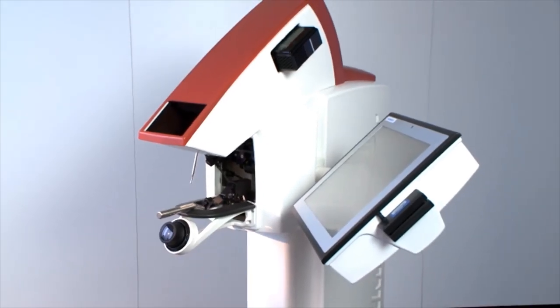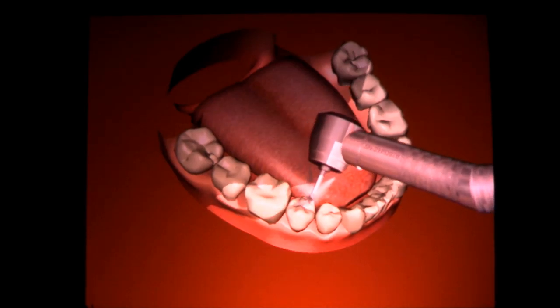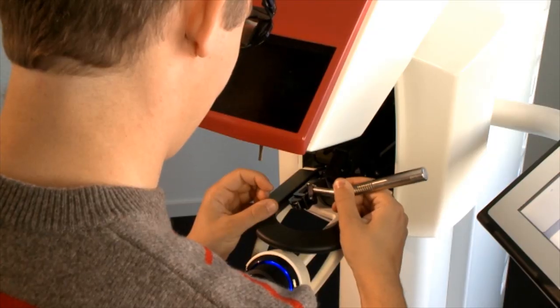The Moog Simodont Dental Trainer is a highly realistic training simulator that combines virtual reality with haptic technology at its best.